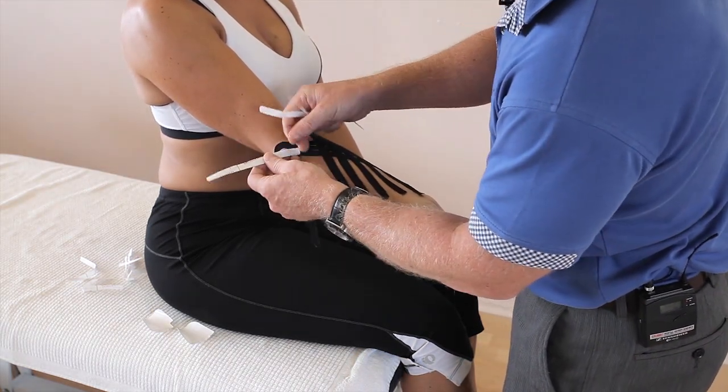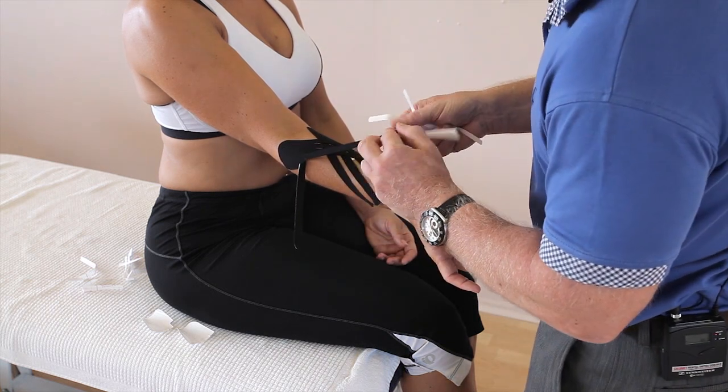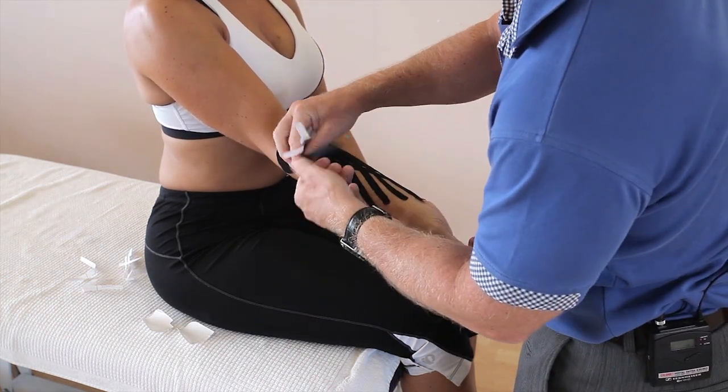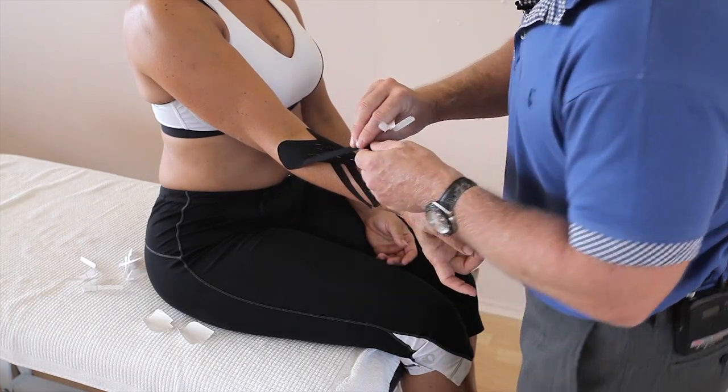This seems to work extremely well with motorcyclists with the muscle pump effect. They use this as a preventative measure as well as a treatment.